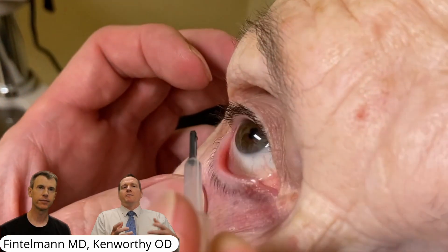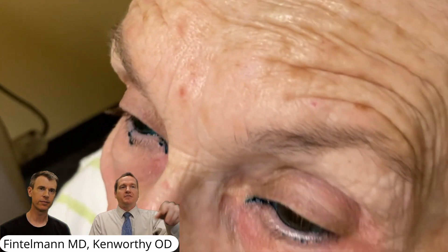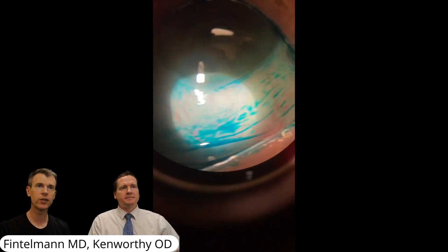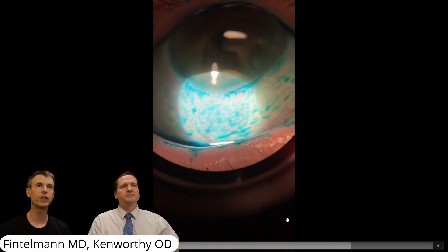With a paper strip, I feel like it's very unpredictable how much actual Lissamine green you're gonna get. This is very precise every single time — the amount of dilution and how much you actually get on the ocular surface. And you can see plenty to see if there's staining with this. If there's not staining with this, there is no staining, so you're never gonna wonder if you used enough.